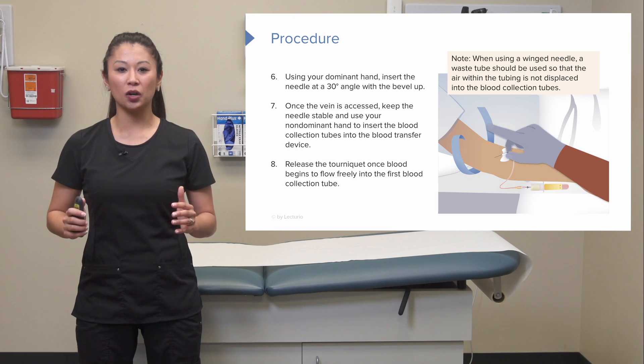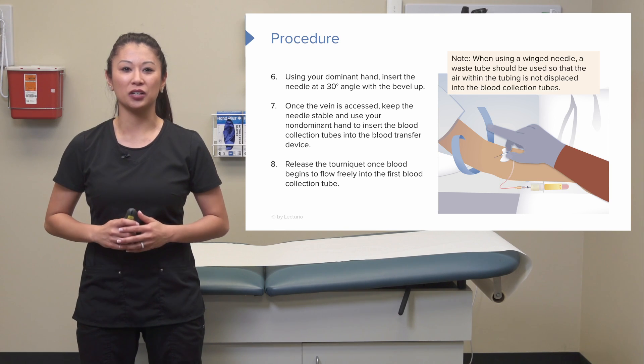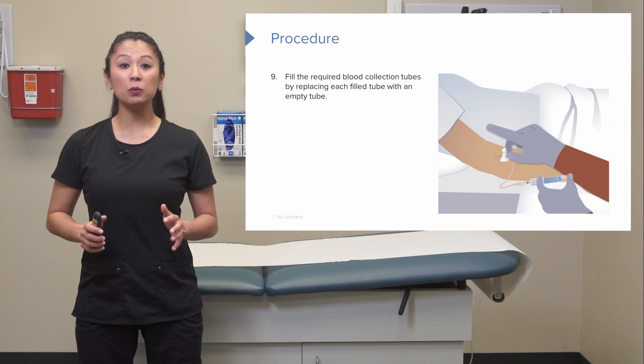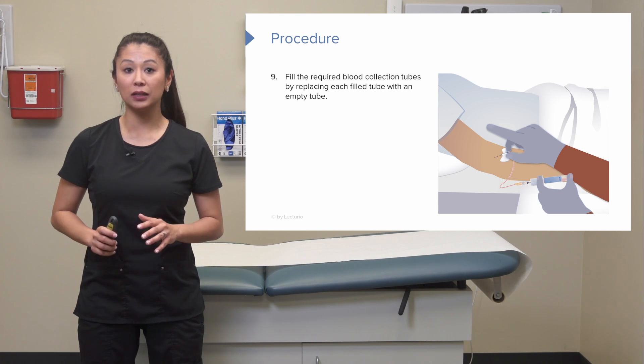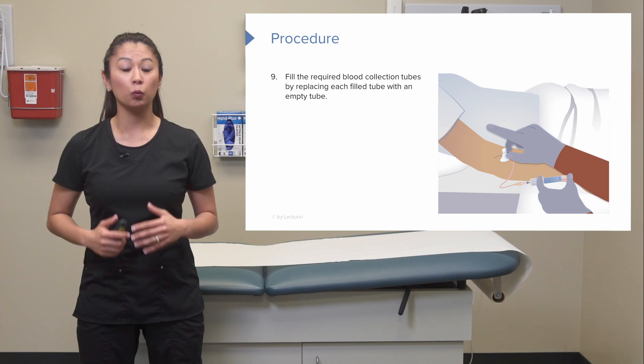We can release the tourniquet once the blood begins to flow freely into the first blood collection tube. We want to fill the required blood collection tubes by replacing each filled tube with an empty tube.